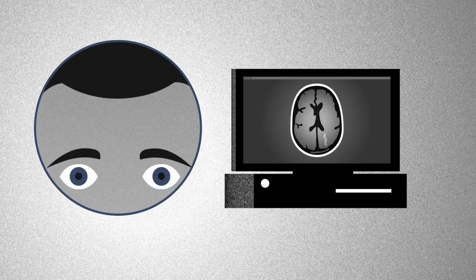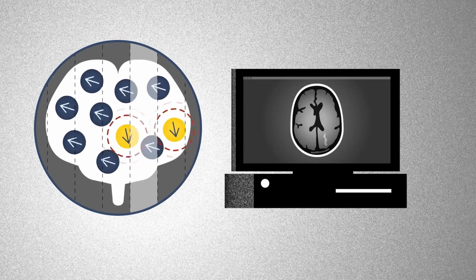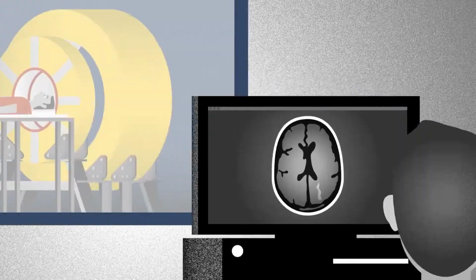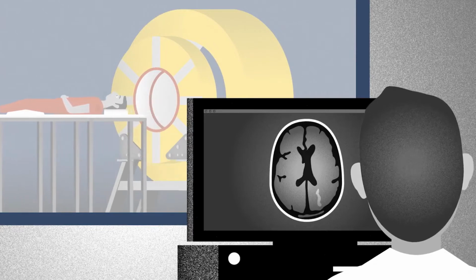The most common MRIs include functional MRI. A functional MRI, or fMRI, tests brain activity. The images indicate whether there are any issues present that may predict or diagnose a stroke. A doctor also orders an fMRI for brain mapping. Brain mapping is essential for brain surgery or for detecting epilepsy or tumors.